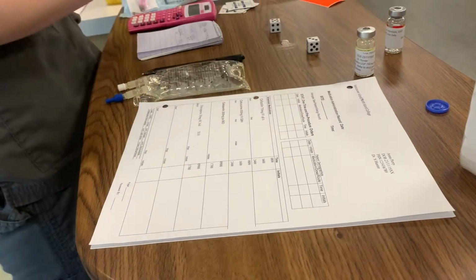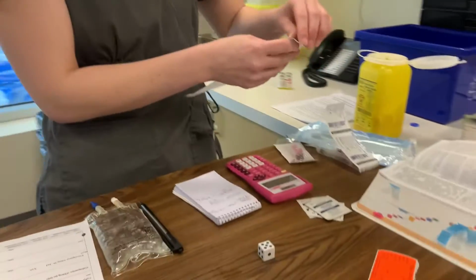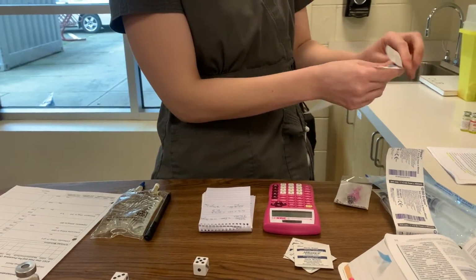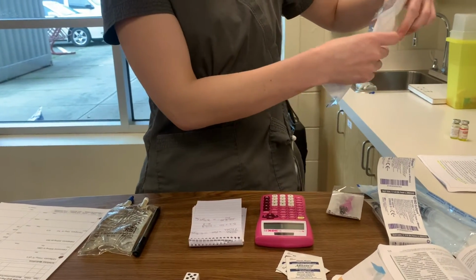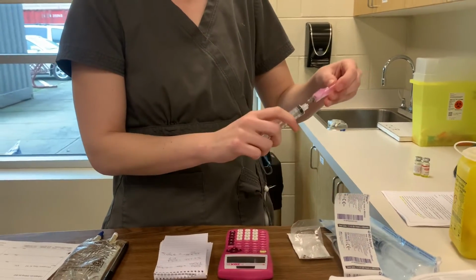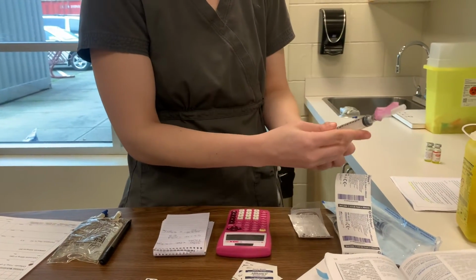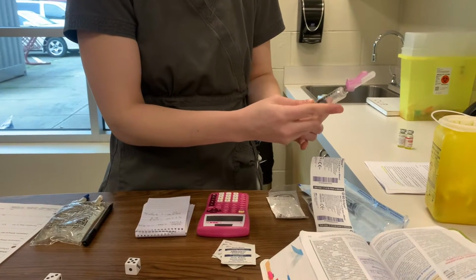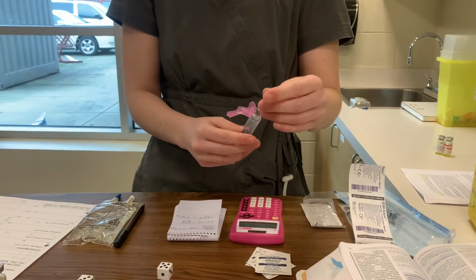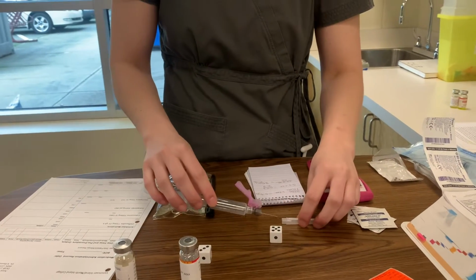So I'm going to use my 10 milliliter syringe here and put 8 milliliters of air into it. I'm going to draw back 8 milliliters, perfect. Sorry, I'm just going to recap this real quick.